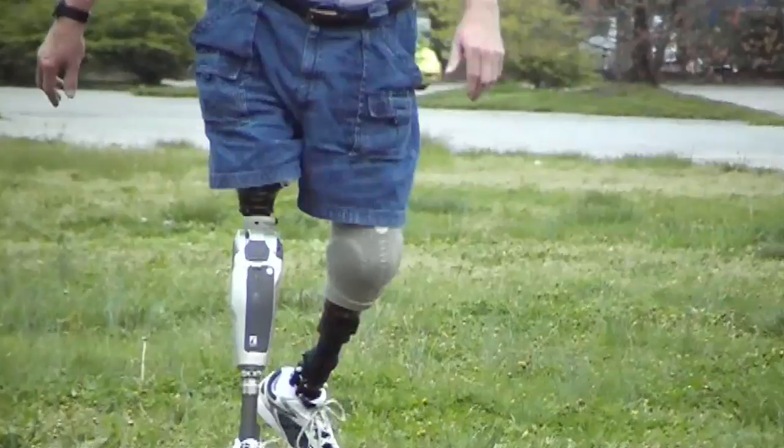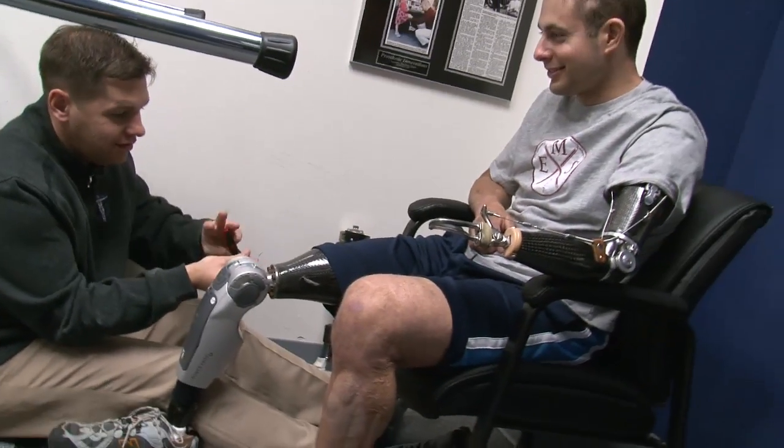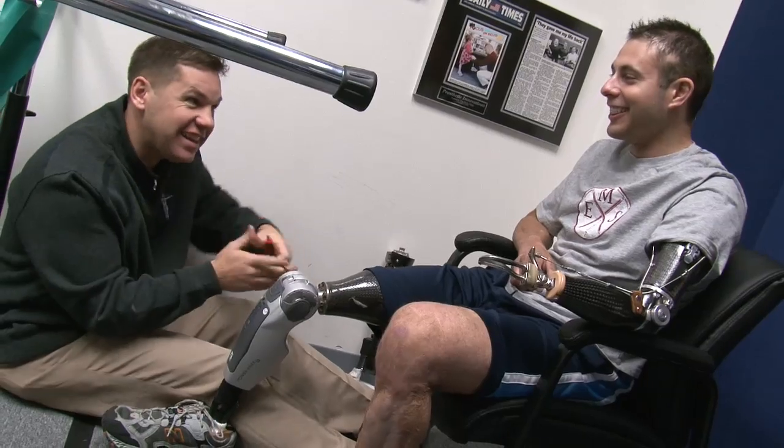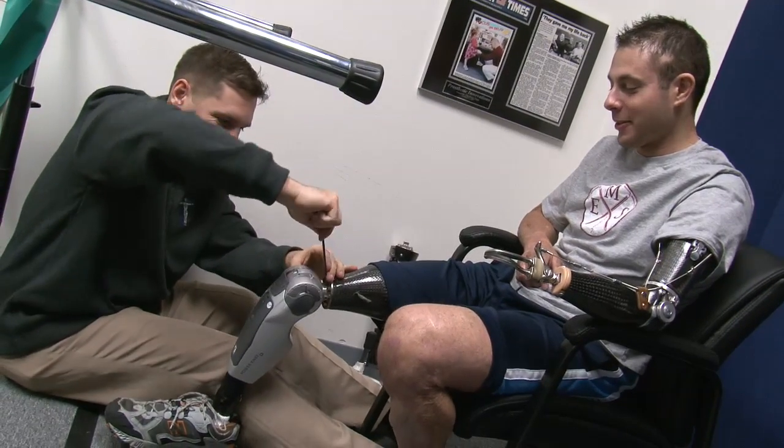Do some steps — yep, good try. Remember your technique, because you're getting it down. The leaning — I think I could do it on the other one.